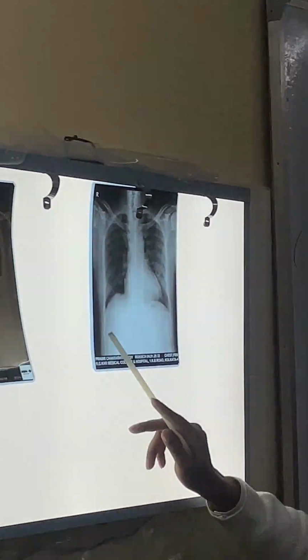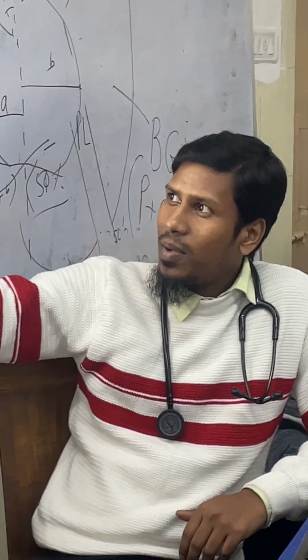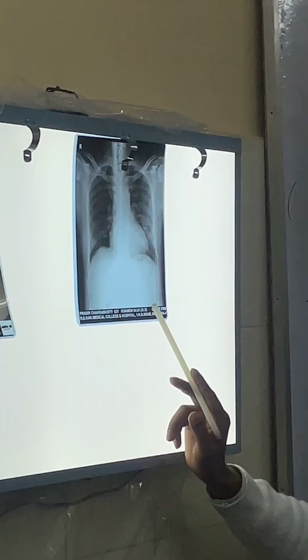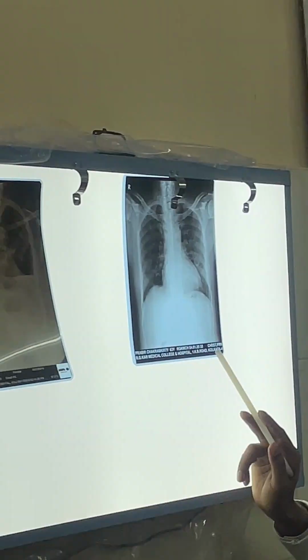Same thing on the right side. If there is liver, due to hepatic density there will be radio opacities there. And in between, if the small intestine has a food bolus, then radio opacity. Or if there is air in the bowel, there will be radiolucency.